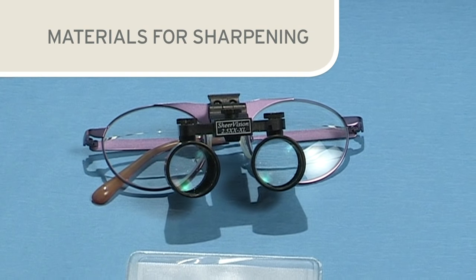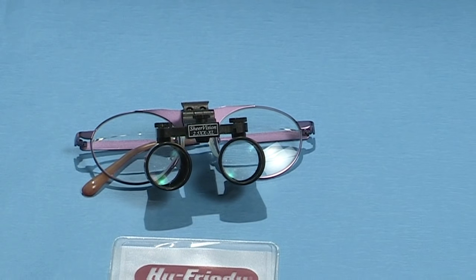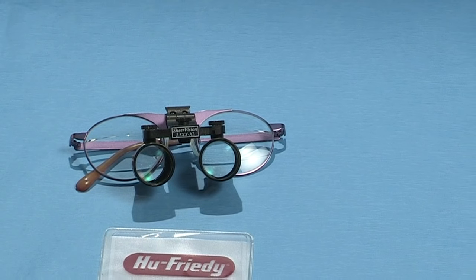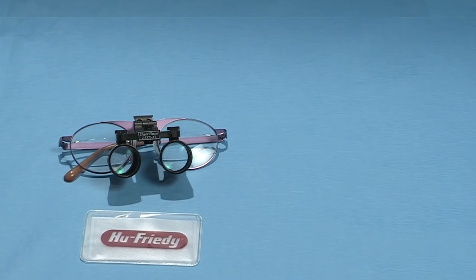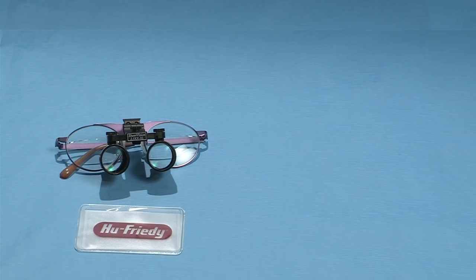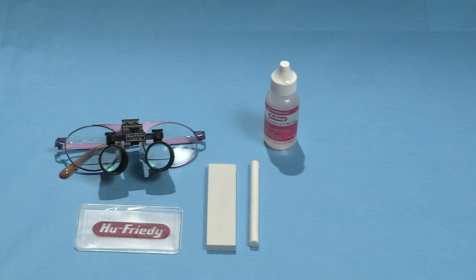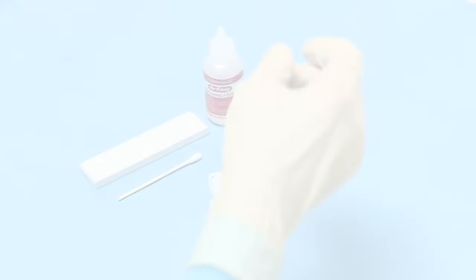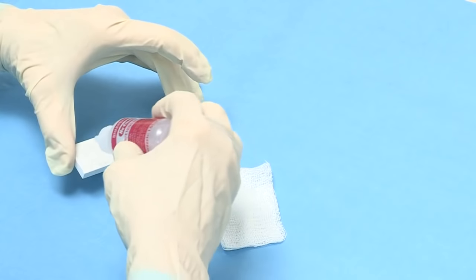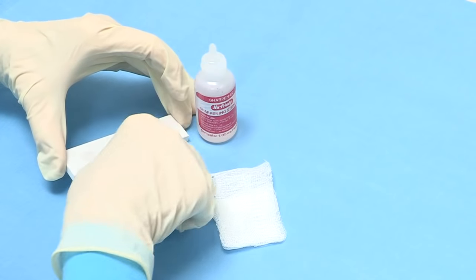Before beginning the sharpening process for sickle scalers, assemble the required materials: a sturdy, flat work surface with proper lighting, loops or magnifying lens, a flat sharpening stone, a cylindrical stone, oil or water for lubrication depending on the type of stone, cotton-tipped applicator, gauze, and an acrylic or plastic test stick. To prepare the Arkansas stone for sharpening, apply two or three drops of mineral grade oil onto the surface and spread the oil on the stone with a cotton-tipped applicator.